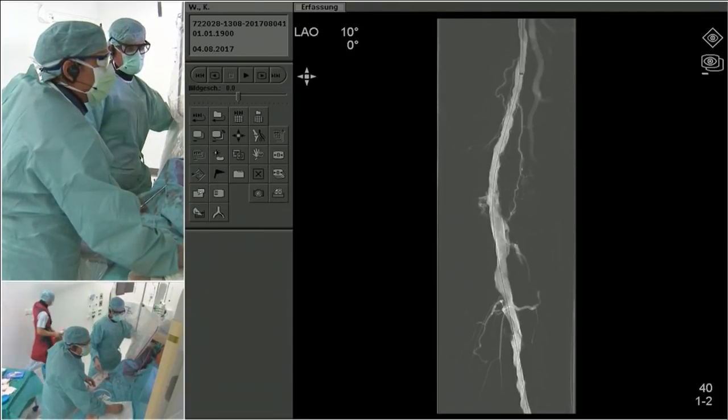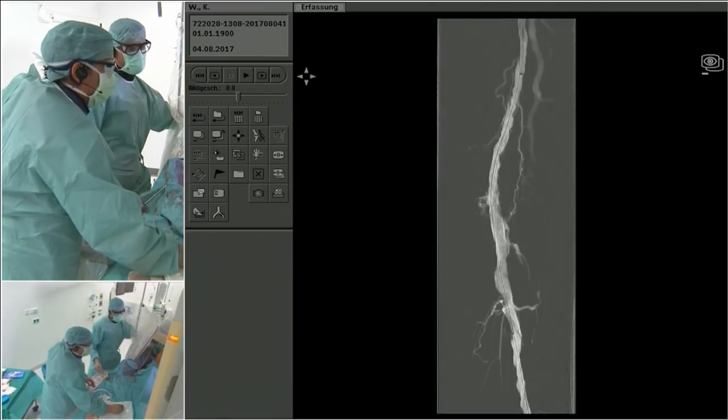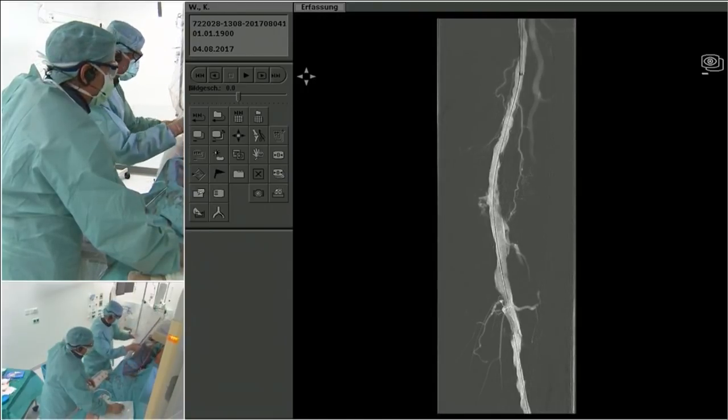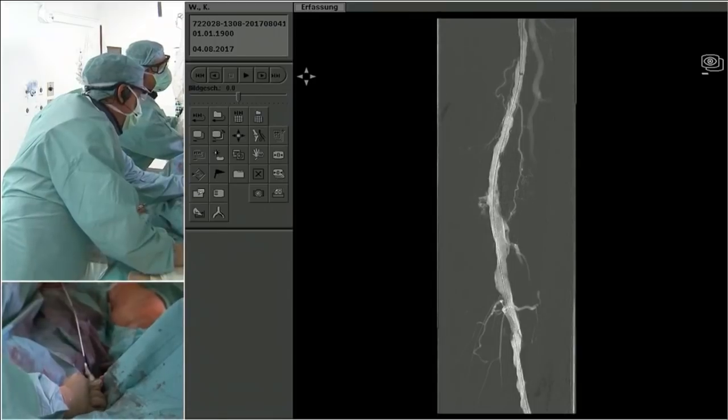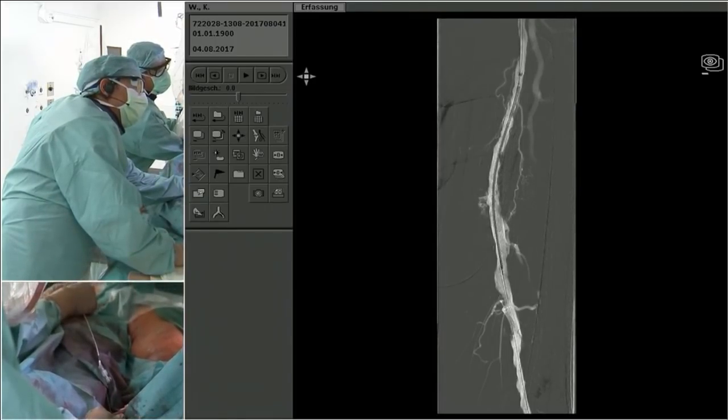Andrej, how's your popliteal lesion doing? Yeah, I haven't checked yet, but clearly need to do this. I think that could be a case for maybe only ballooning, drug-coated balloon, or, I mean, at the end, a short Supera stent, I think, is also not a mistake indeed.